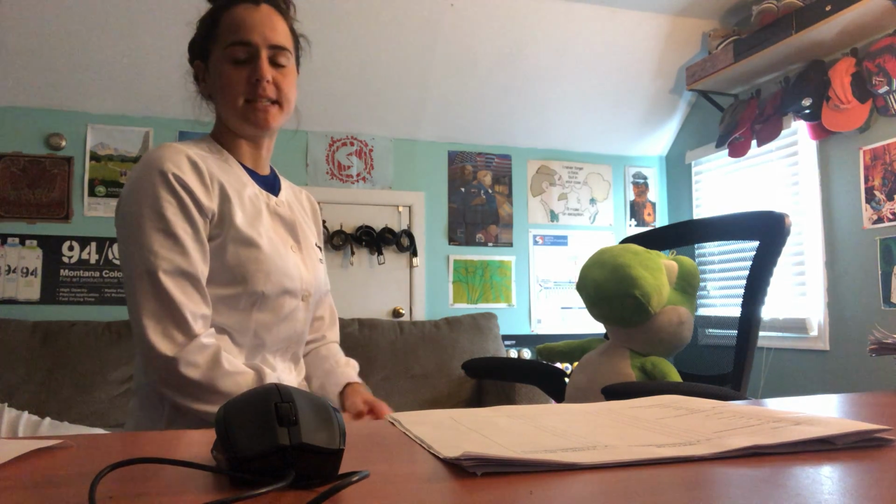A lot of the time you can leave the sling on while they're sitting. It's just so when you have to move them back, you can just hook it right back on and use that. So now I did also learn that some of them are operated mechanically, some are manual. So you will definitely want to become familiar with that specific machine. So what I gave you was just the basics of how you would use the Hoyer lift. Thank you.